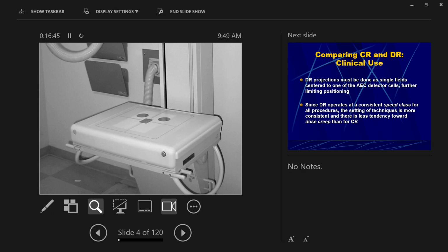It's one of the things that people worry about the most, setting your technical factors for the image you're going to take, okay? Kind of like on your phone when you take a picture, you have to make sure the exposure lasts for a certain amount of time so that it's not overexposed or underexposed, too white or too dark, okay?